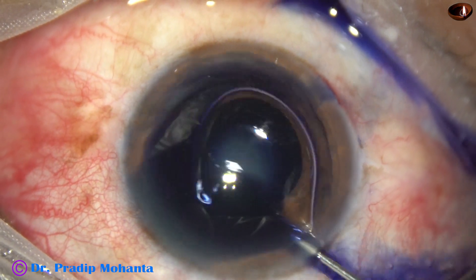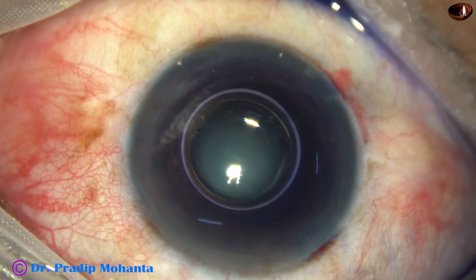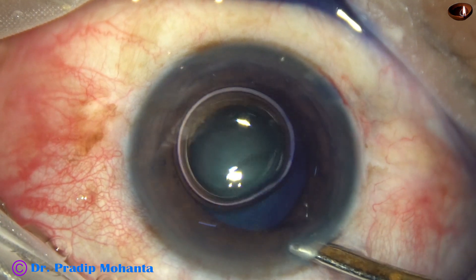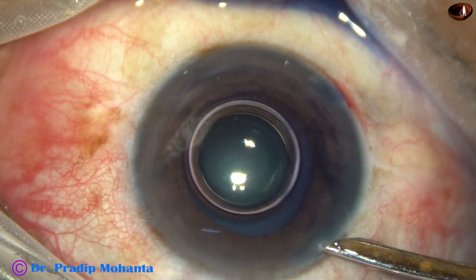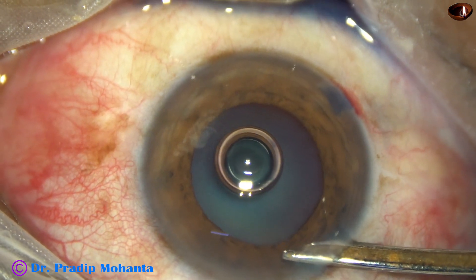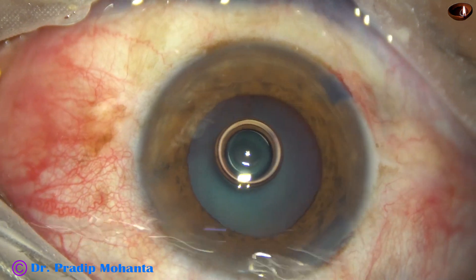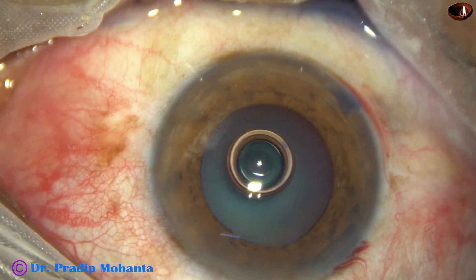This is adrenaline. But adrenaline does not always do the job. We cannot expect that in every case adrenaline will cause dilatation of the pupil well. But in this case, the pupil has dilated to some extent.